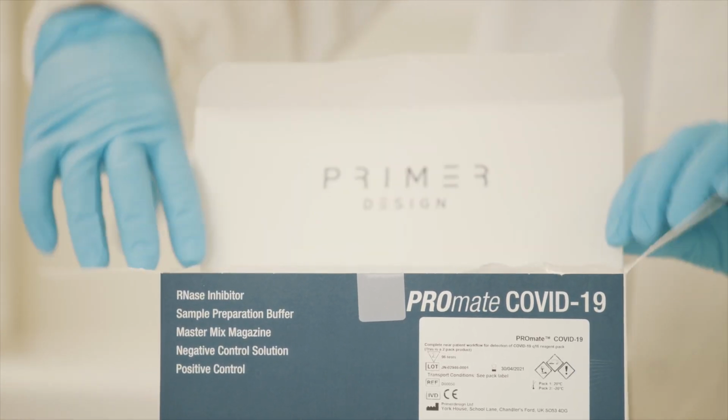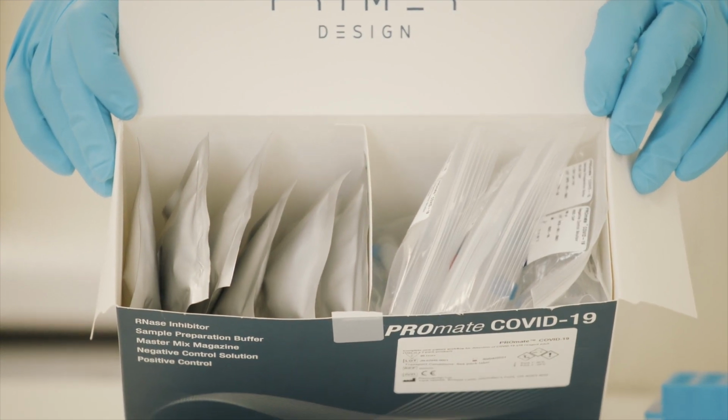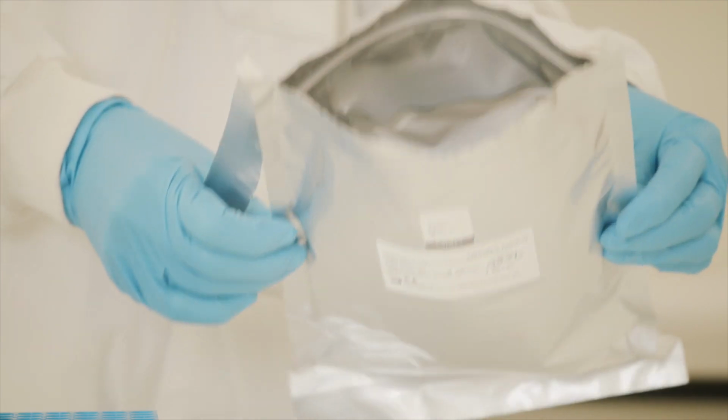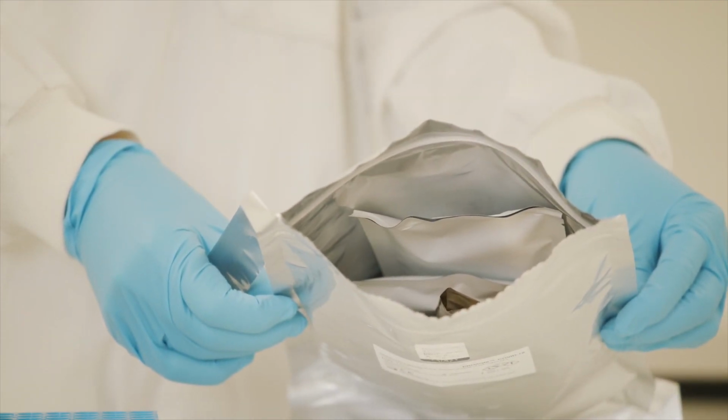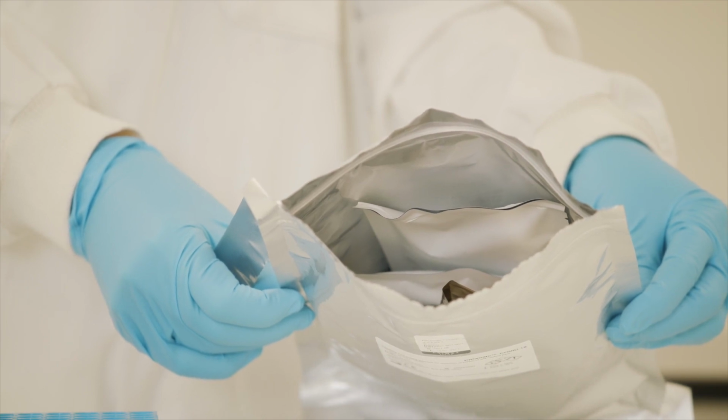PROmate comes in two packs. Pack 1, in cardboard packaging, is shipped at ambient and should be stored at ambient. Pack 2, a large foil pouch, is shipped on dry ice and should be stored at -20 degrees Celsius.